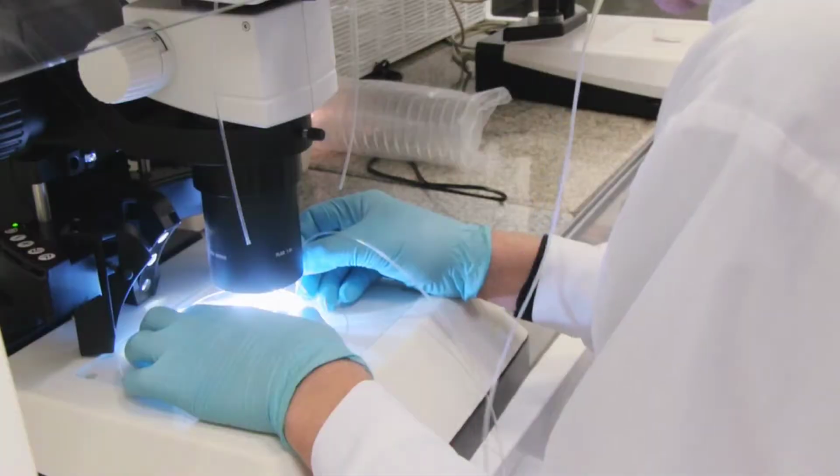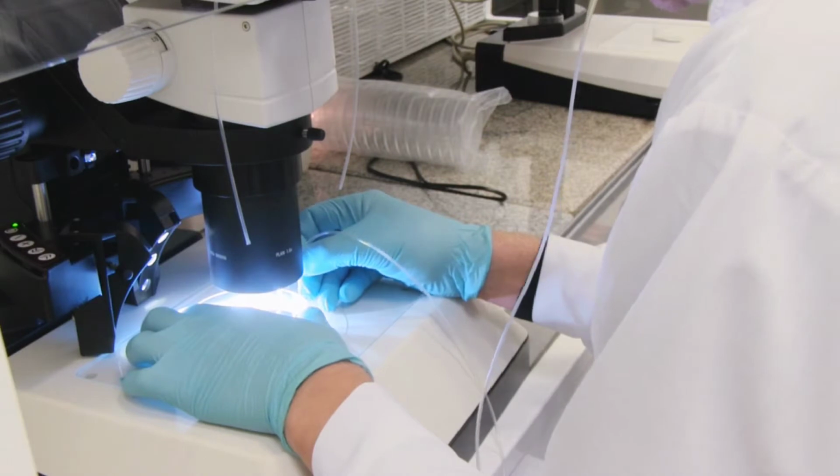Microscopy simply means spinning the urine sample. After spinning it, you decant the supernatant and view the deposit under the microscope. Just get a drop of that deposit, put it on a slide and view under the microscope. It will tell you a lot of things. You'll see a lot of things in that drop of urine. So what are the things that can be seen in the urine deposit?